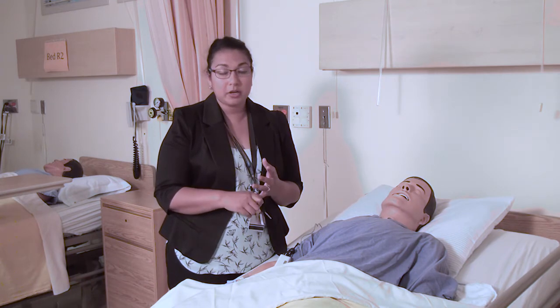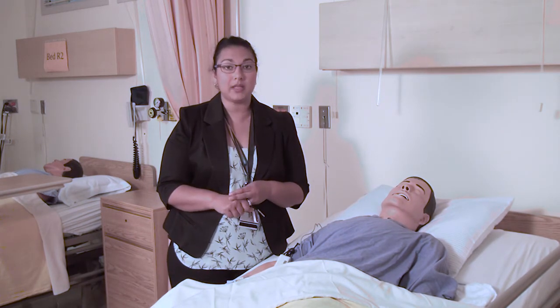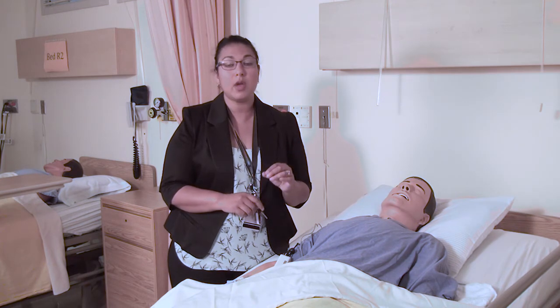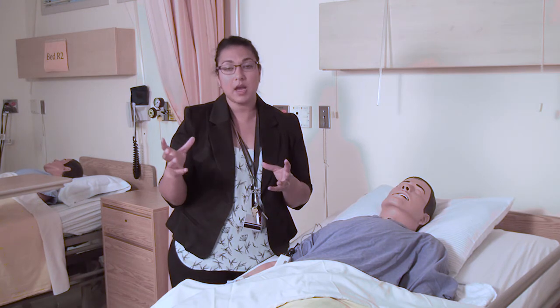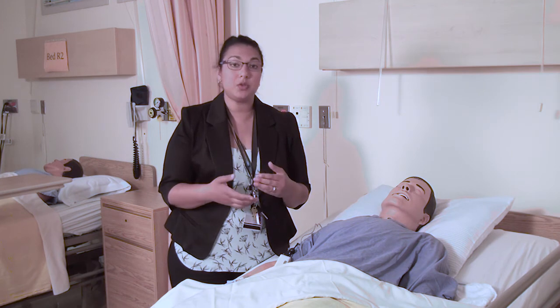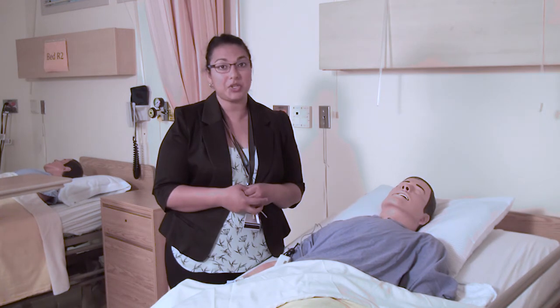So if it's prepared incorrectly or if it's programmed incorrectly, and this is why it's a 2-nurse check. It's important that it remains a 2-nurse check and that the nurses are carefully going through both the pump when it's being programmed and also the reconstitution when it's being prepared in the medication room. So because 2 nurses could make the same mistake, which would create a really big, dangerous medication error.